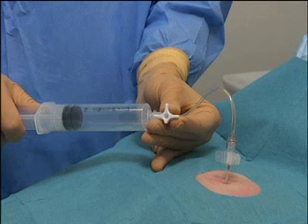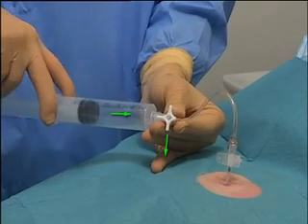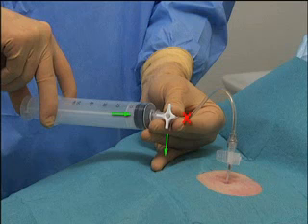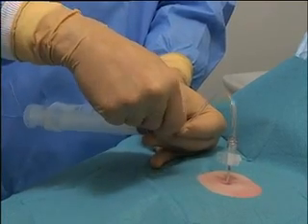To evacuate the air into the ambient air, you must turn the stopcock so that the syringe is connected with the environment, but not with the patient. Make sure that the pleural space is never connected with the environment while you are turning the stopcock.